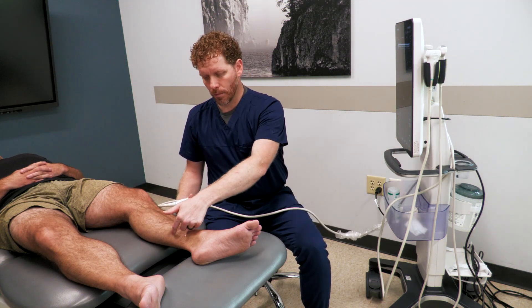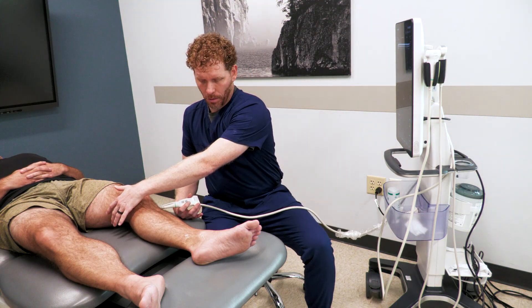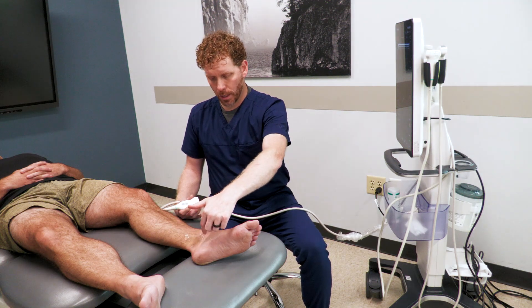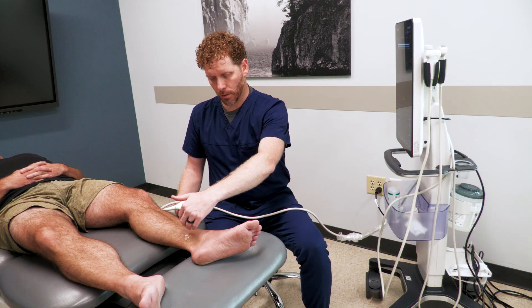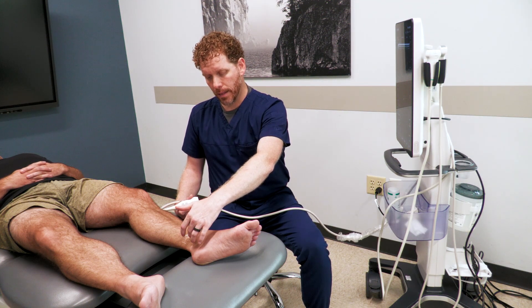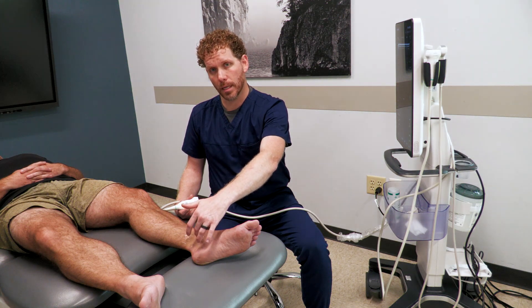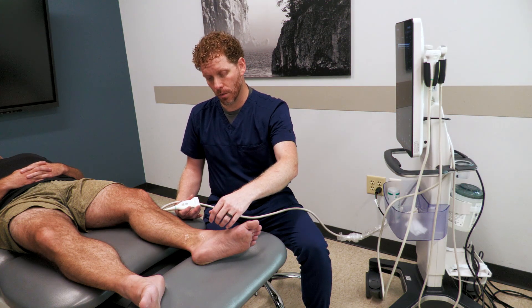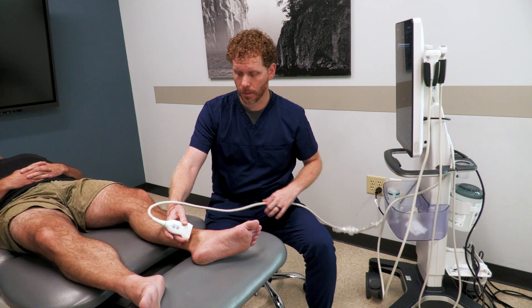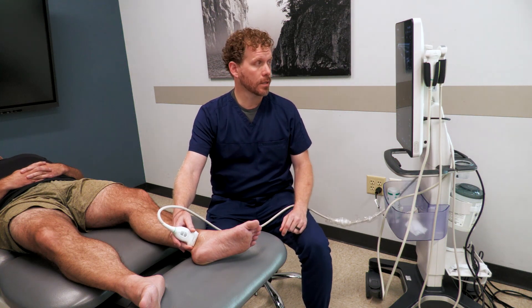The tibial nerve branches off the sciatic in the posterior thigh, makes its way through the musculature along the backside of the tibia, and then becomes fairly exposed at the posterior medial malleolus, where it branches off into a few nerves in the foot. We'll talk about those more at the upcoming conference.